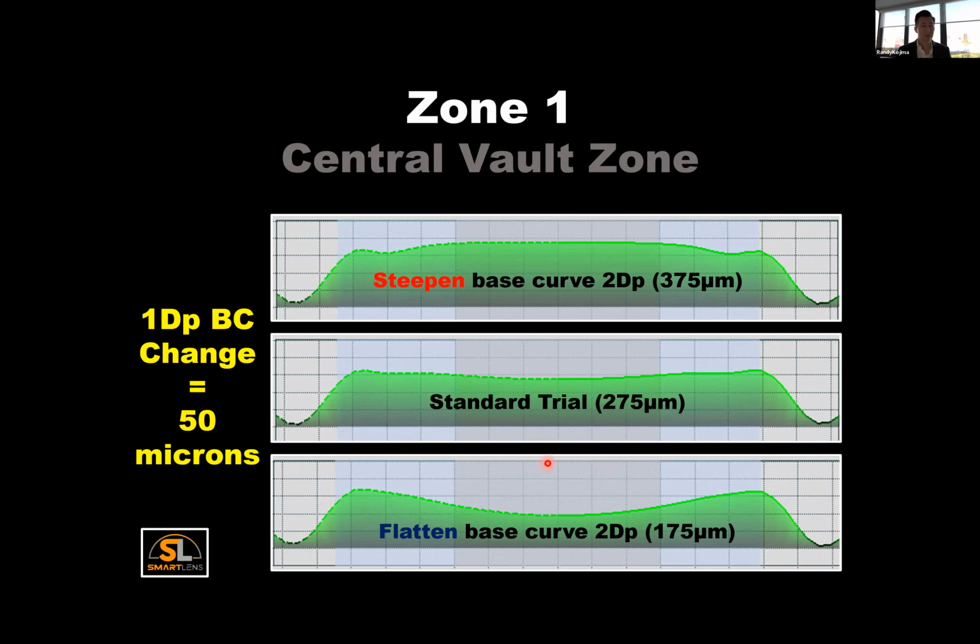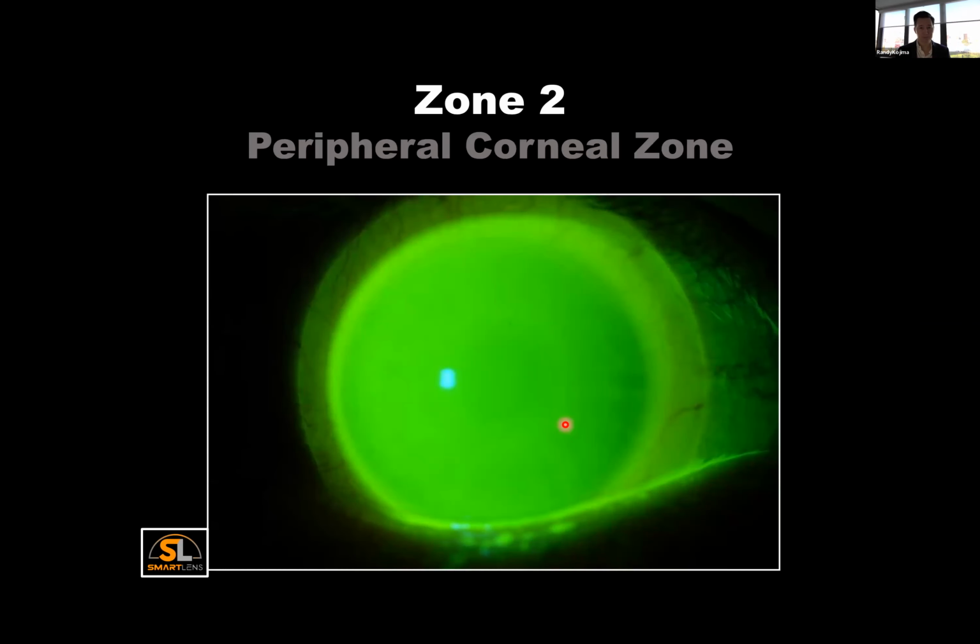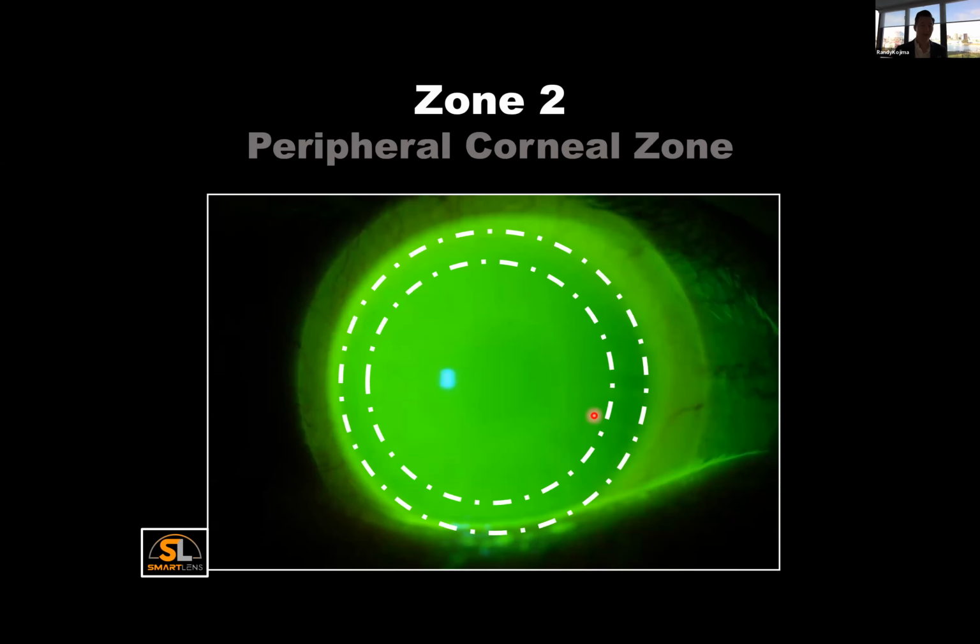But there's an easier way to do it where you don't have to compensate for the lacrimal lens power, the SAM and FAP factor. And that's to use the second zone in the lens. The second zone is kind of like an elevator that lifts or drops the center optic zone. So we use this one frequently to alter the height of the lens.